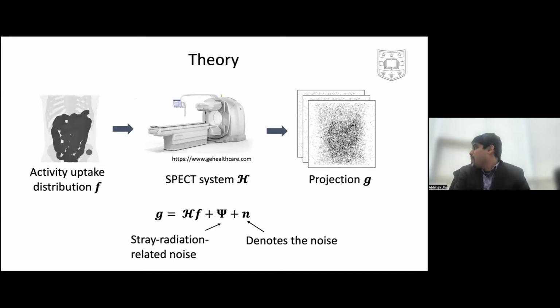If you want to do tumors that you cannot see on CT, can you do SPECT first? Yes. So you do recon once, you define the ROI, and then you go back. I like to think of this approach as complementary to reconstruction-based approaches, because there are lesions that we are not able to see on the CT scans. So what you can do is do a SPECT reconstruction, use that to define the VOI, and then use this approach.